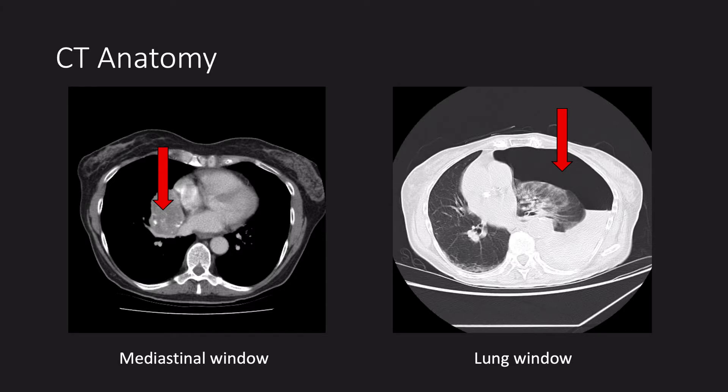On CT, we can look at different tissues by altering something called the windows. On the left, we have a mediastinal window demonstrating a large right hilar tumour. When you look at a CT, remember you view it as if you were looking up from the patient's feet. On the right, we have a lung window which highlights air. In this case, there is a large tension hydropneumothorax on the left. Look at the heart being pushed into the right side of the chest causing tamponade.